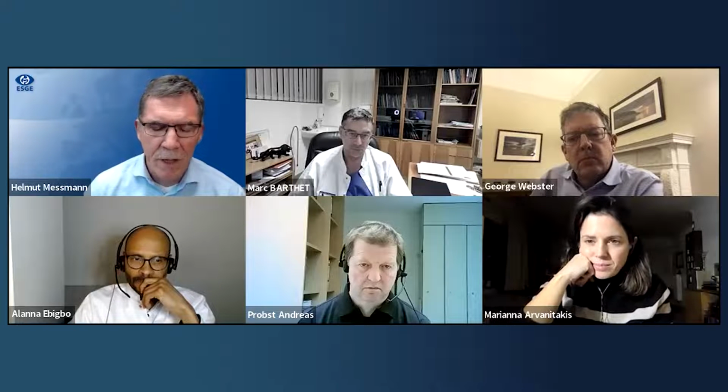Agree. I would do EUS, not MRCP. Depending on the size of the lesion, a small lesion, 1 centimeter, I would just take it out. A diagnostic resection, no EUS is necessary in this case. If you have an increase of the bilirubin, for sure, you can expect an obstruction. Then EUS is definitely recommended. And then we always do a papillotomy, because sometimes an intraductal adenoma protrudes and you can resect it. For sure, this is not curative, but in an elderly patient, I think it's an option to avoid aggressive surgery.